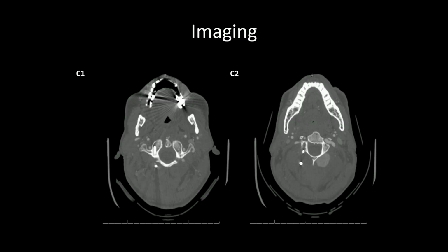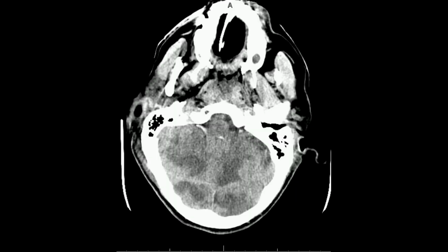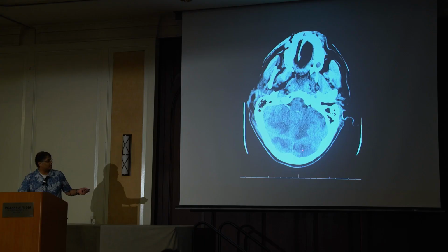So you can see here, the patient was then sent to me at UCSF, and there's a hematoma here from that injury, and he had packed a whole bunch of Gelfoam and whatnot in here. This is the dominant vessel here. This side had screws in it. This side, he left the screws out and sent the patient over. This was the posterior fossa of that patient. So this is what happens when you get a dominant vertebral artery injury.